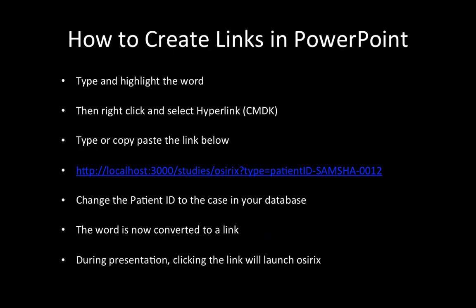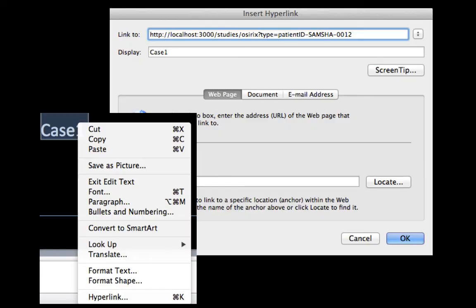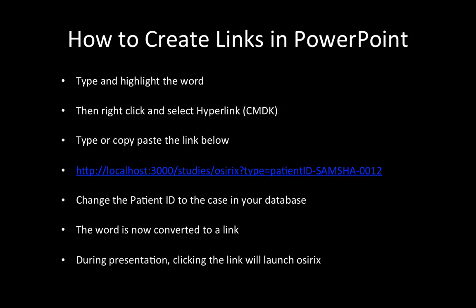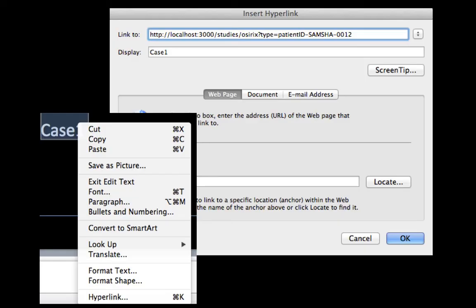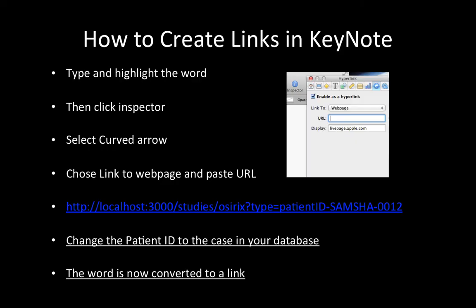Now I'm going to demonstrate how to create links in PowerPoint. Type and highlight the word, then right-click and select Hyperlink. If I have selected 'case' and right-click, you will see an option called Hyperlink at the bottom of the secondary options. Then type the link as shown in this demonstration and change the patient ID. The word is now converted to a link, and during presentation clicking the link will launch OSRx.